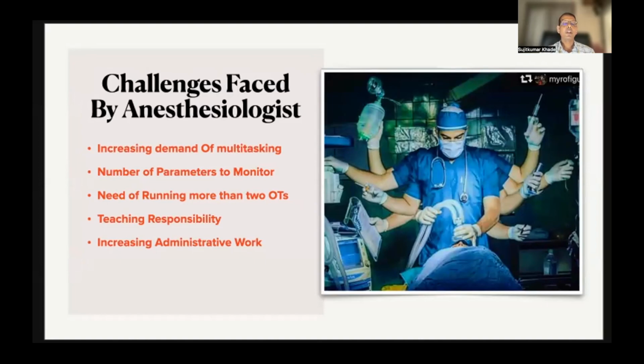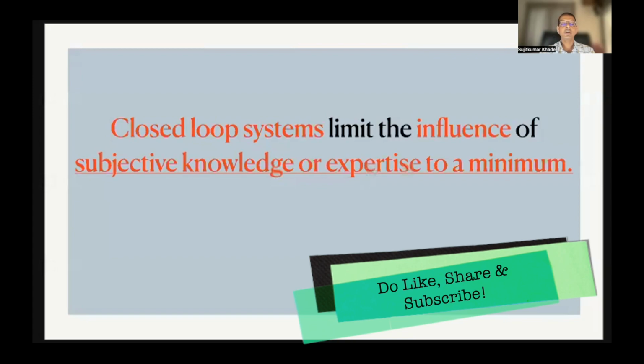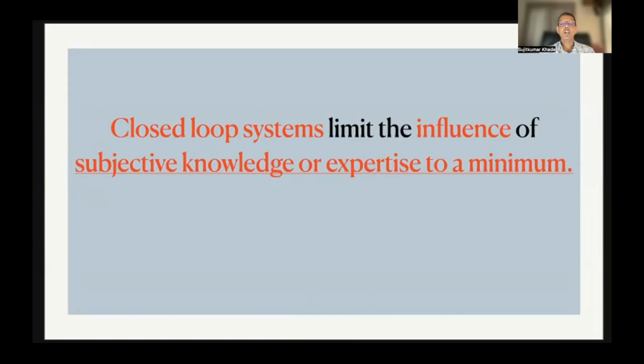It is therefore not surprising that one of the common denominators of studies comparing closed loop control versus manual control is the finding that humans change a given target infusion rate far less frequently than the closed loop devices do. The closed loop systems limit the influence of subjective knowledge or expertise to a minimum. This is vital in reducing the workload of expert anesthesiologists. At the same time, CLADS will assist them in performing more anesthesia procedures in the same allotted time. It will also give remotely placed patients a chance to get world-class anesthesia services which are precise and safe.